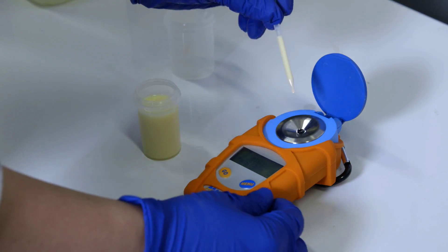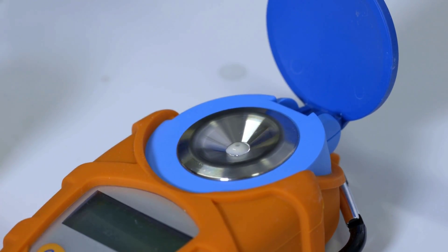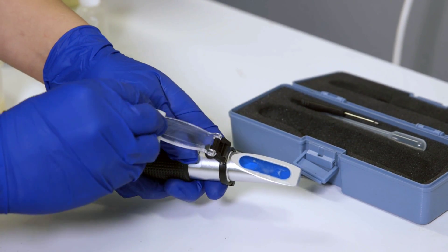For the test, simply place a drop of colostrum in the device. Consult the manufacturer's instructions for details, and make sure you properly clean and store the device.